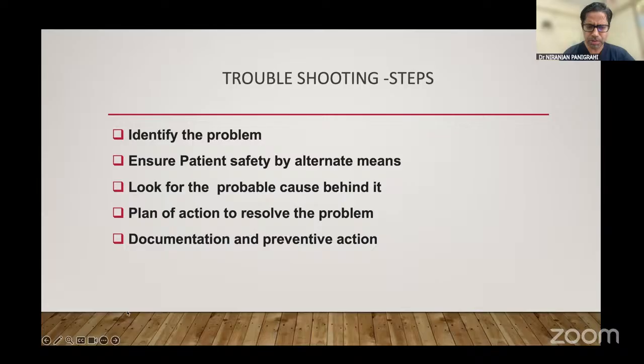Now, there are so many other rare problems that can happen. We'll not go into the details, for the students' understanding's sake. These are the commonly encountered problems. So what should we do? First, as I told you, patient safety. Make sure your patient is safe. Identify the problem. Then look for the cause behind it. Then plan of action. Then documentation.